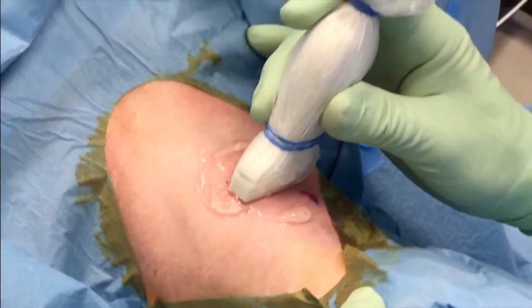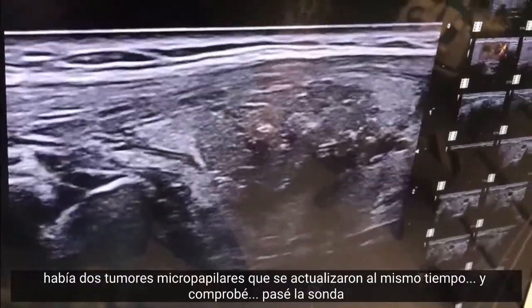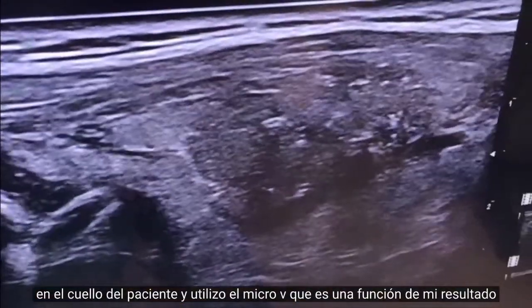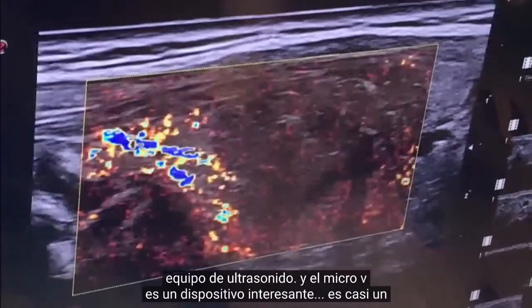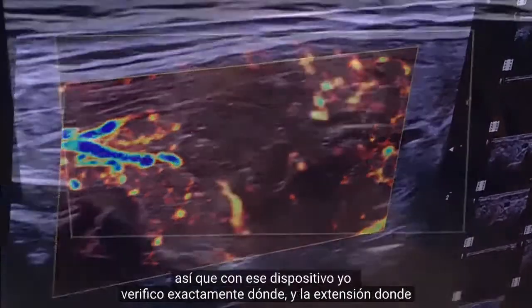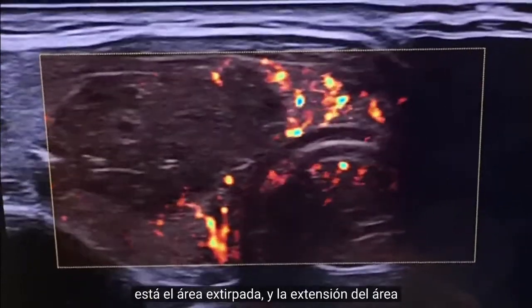Maybe you have some images of micropapillary tumors that I ablated recently. In these cases, there were 2 micropapillary tumors that were ablated at the same time, and I checked, I passed the probe upon the neck of the patient, and I used the micro V, which is a function of my Esaote ultrasound equipment. And the micro V is an interesting device. It's almost a contrast media device, which shows exactly the ablated area. So with that device, I check exactly where the ablated area is and the extent of the ablated area.